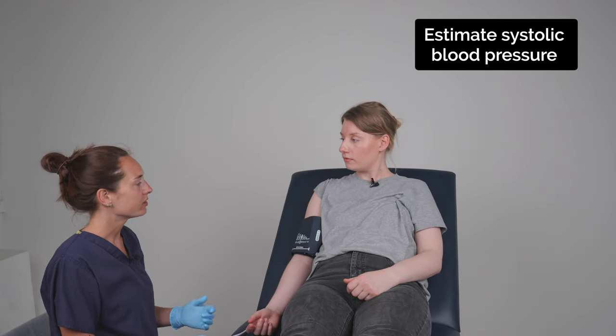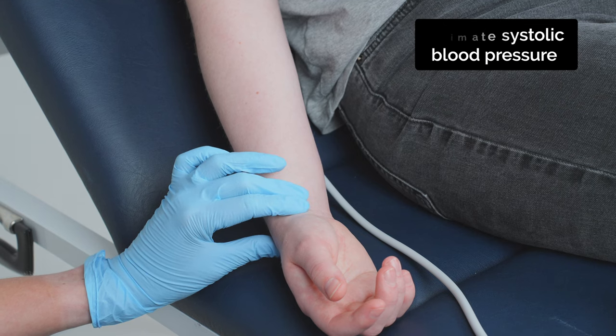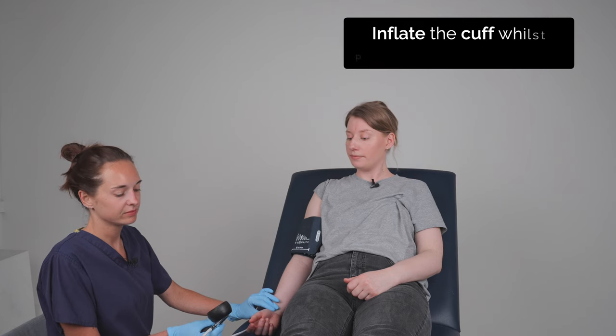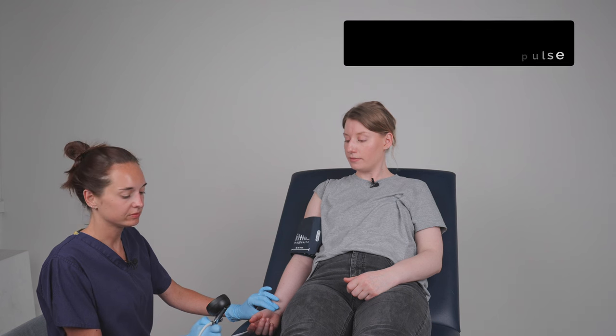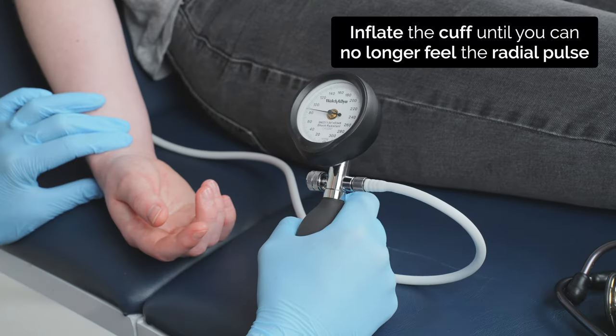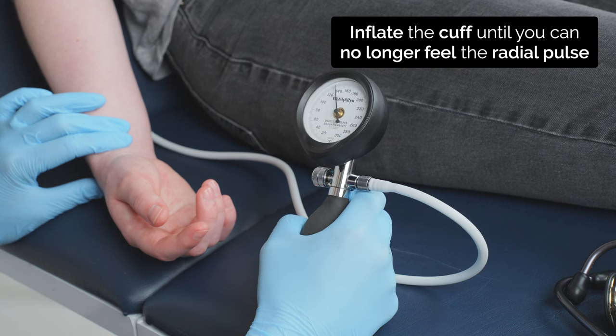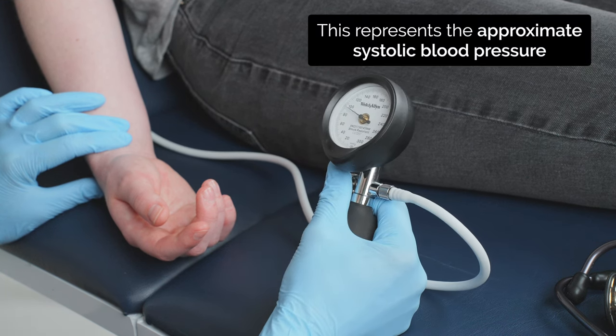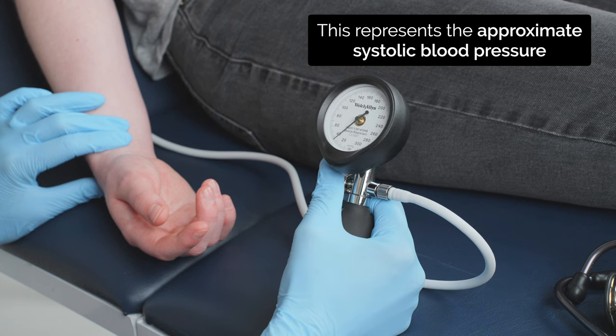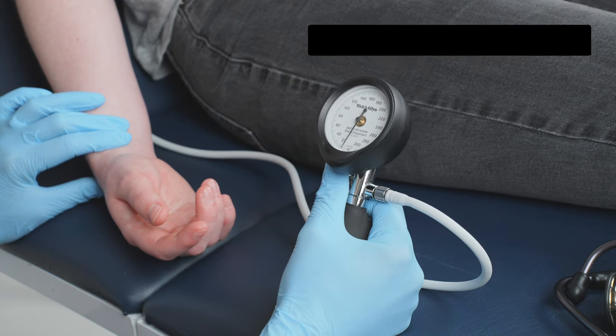So first I'm going to inflate the cuff while having a feel of your pulse at the wrist, is that okay? Yes. If it's too uncomfortable just let me know. Great. How was that? A little tight but not uncomfortable. Are you happy for me to do the same thing again? Yes, of course.